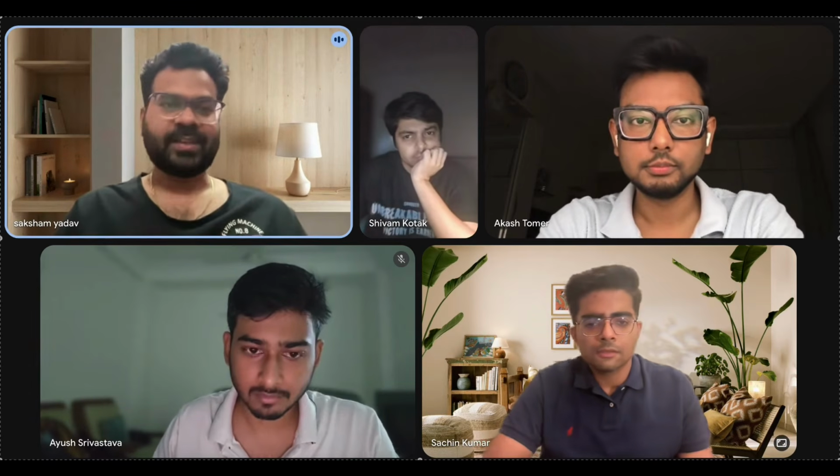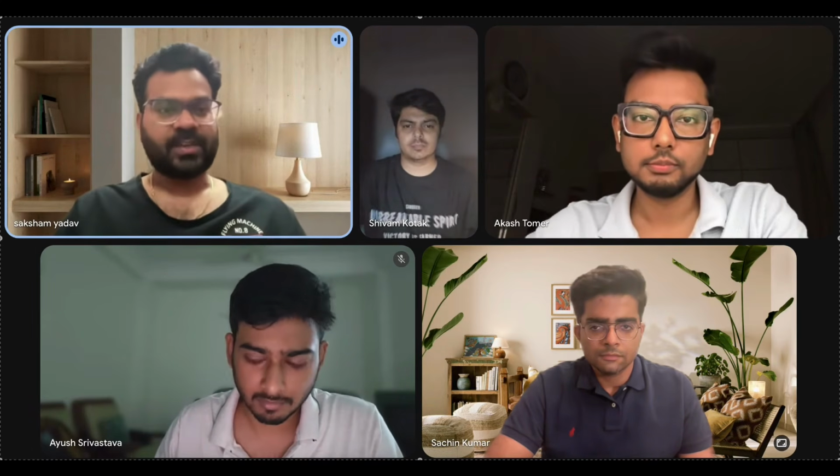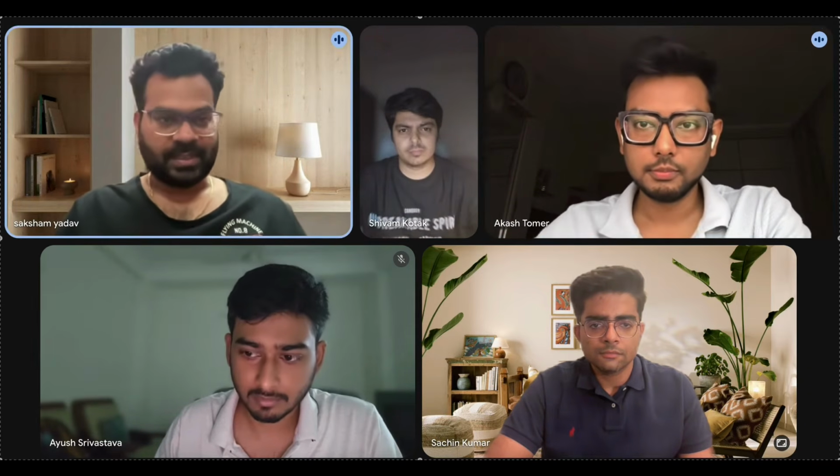Hi, I'm Dr. Saksham. As a radiologist myself, I have many times felt the burnout and the frustration of dictating everything, spelling every syllable of findings, and then typing every lumbar spine report. It was quite frustrating. And when I found Quillr, it was the only tool which I saw that is really hearing the radiologist's voice, and is not replacing clinical judgment with a black box AI thing.